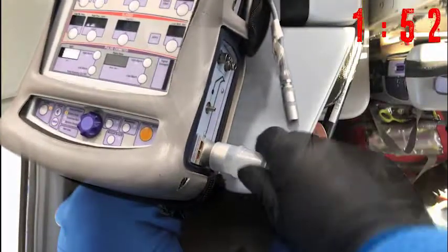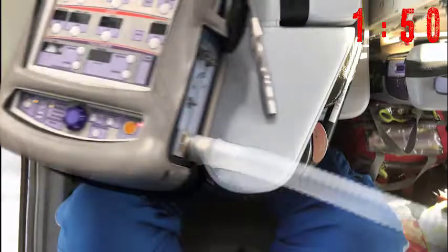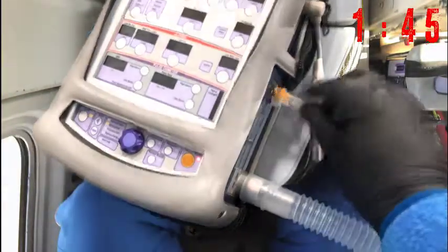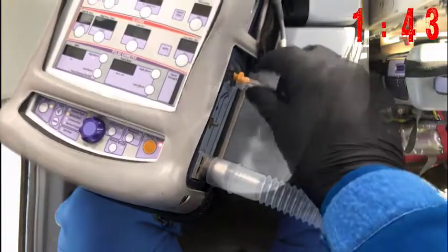Connect the circuit securely to the inspiratory port — it can easily be knocked off. When connecting the lines to the sense line ports, give them a little twist prior to putting them on so they won't vibrate loose.